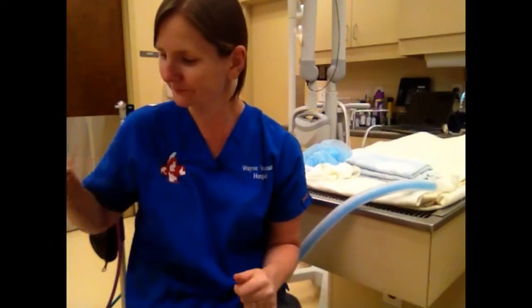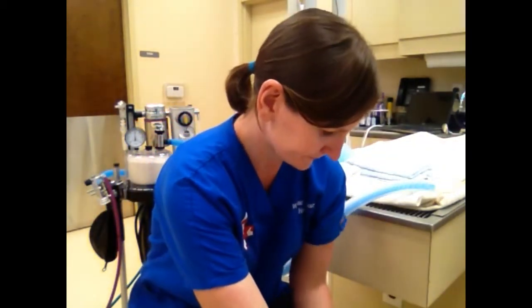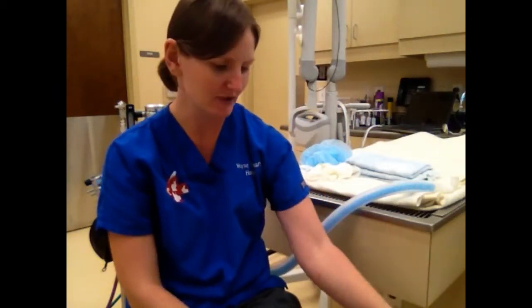Once all the calculus has been removed from the teeth, we'll go ahead and rinse the teeth. So I have my handheld rinser again attached to my dental machine. This one blows air and water to remove debris from the teeth, or from the mouth. Once we've removed the debris, we would polish the teeth.